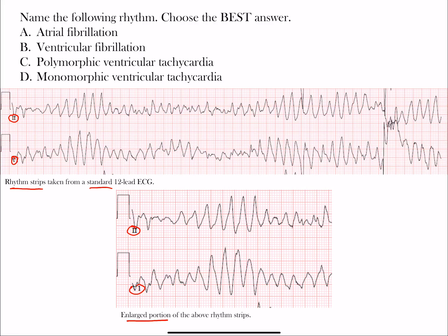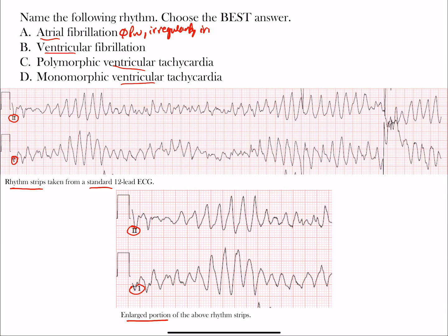Hopefully you had a chance to think through it. Let's go through these one at a time. Notice first off that we have in our answer choices one atrial rhythm and three ventricular rhythms. Now, if you were to measure some of these out, you may actually find that the intervals are pretty close.